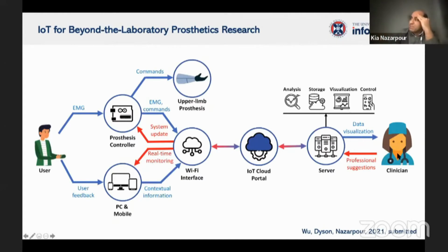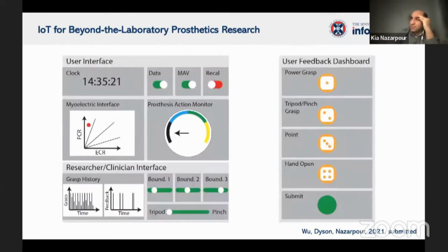And then we would be able to link with the clinician and provide reports about the use of the prosthesis in almost real time for the user. We designed two apps, one for the clinician and one for the user, where the user would be able to see what happens in the prosthesis in exact real time.